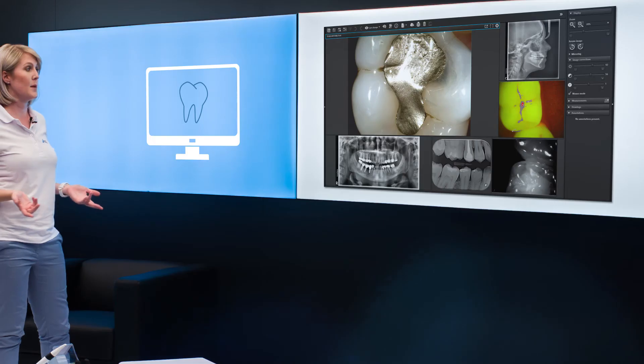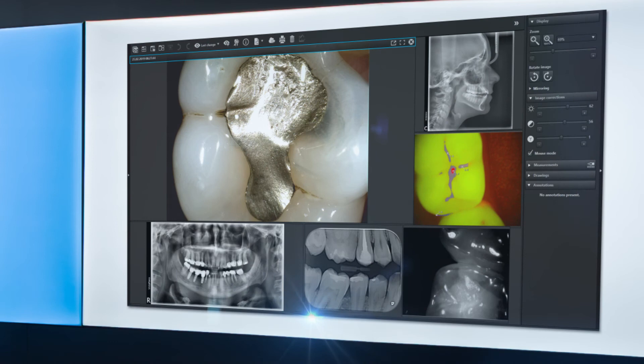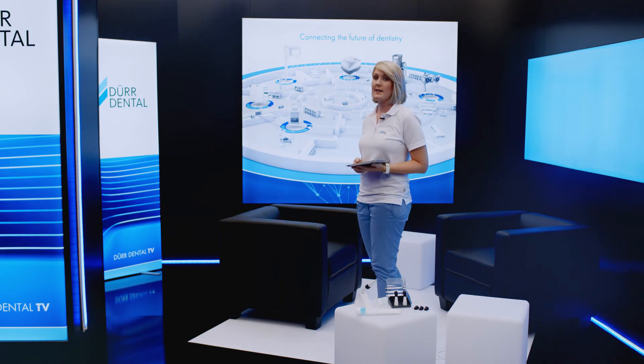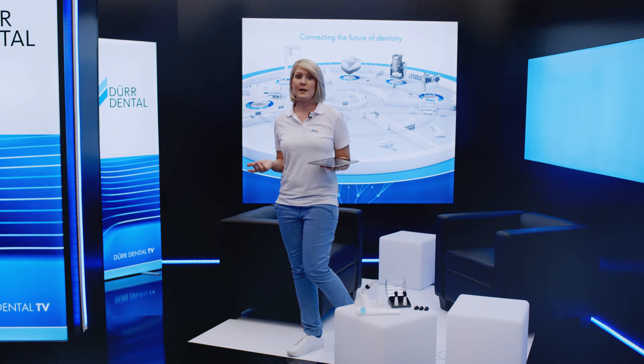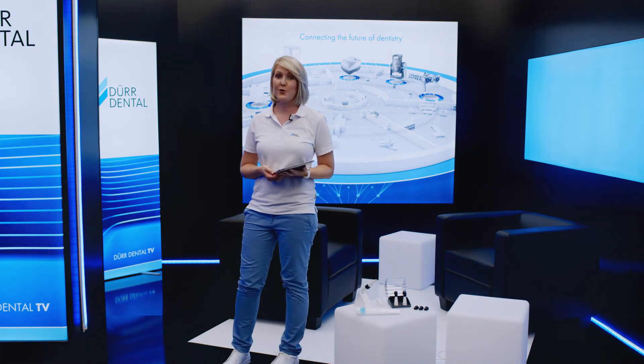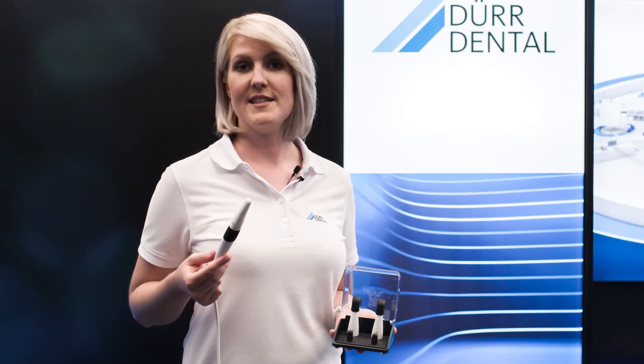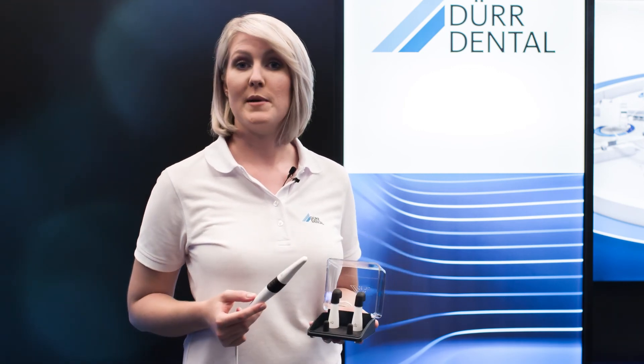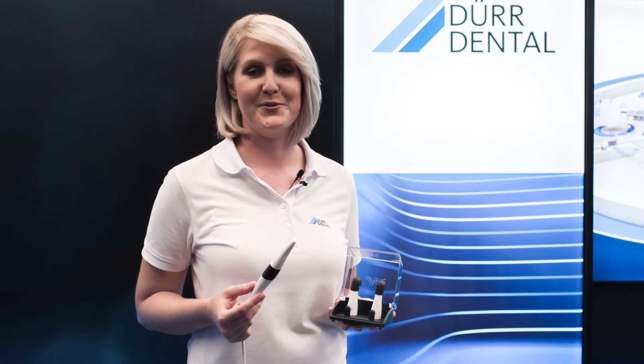The Vistasoft imaging software allows you to display camera and X-ray images together on a digital light table. And with the imaging app, you can even display image files on an iPad. This makes it even easier to link everything up throughout your practice and simplifies communication with the patient. The Vistacam iX-HD Smart with its three interchangeable heads is a real gain for every dental practice.